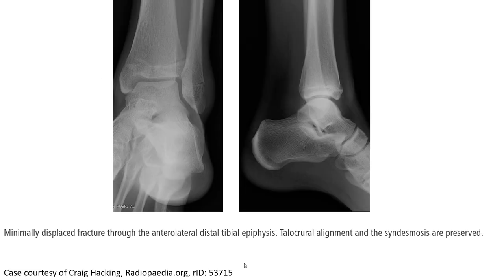This is a good example of a Tillaux fracture. We can see a minimally displaced fracture through the anterior lateral distal tibia epiphysis. The talocrural alignment and the syndesmosis are preserved. A lucent fracture line goes from the medial aspect of the epiphysis across the epiphysis of the distal tibia.